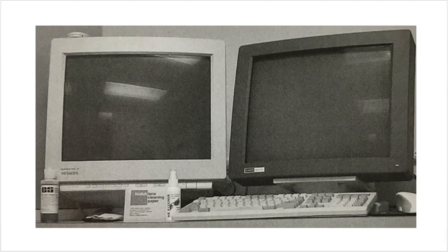Right. So here you can see the lights of the hallway in this monitor, right? So this is specular reflection, right? So I'm getting a mirror-like image on this monitor.